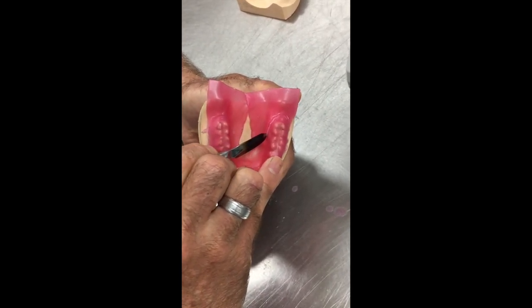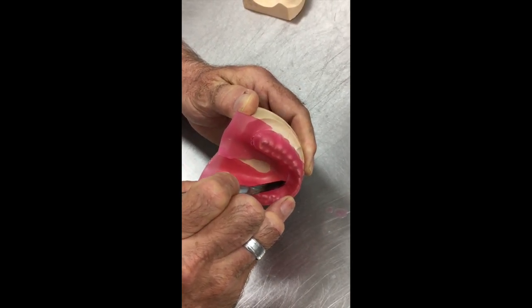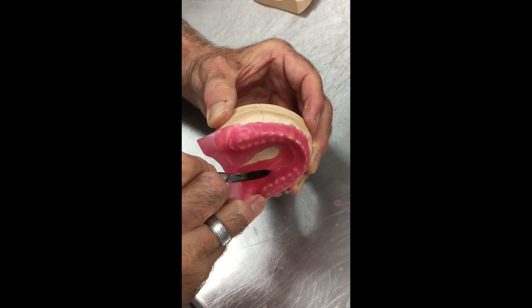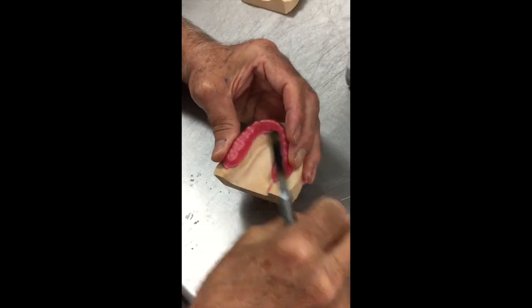Now I'm using a thermo wax knife heater here, but this works equally as well with a Bunsen burner for those situations where only a Bunsen burner is available. It's exactly the same procedure, just lightly heating your knife and going around and cutting this off like so.